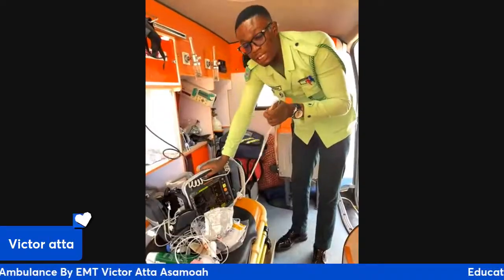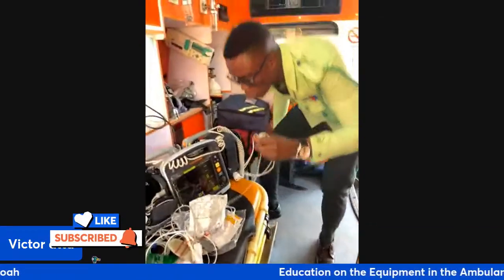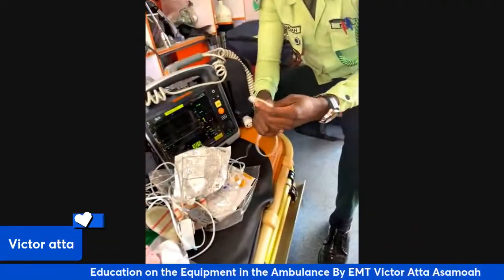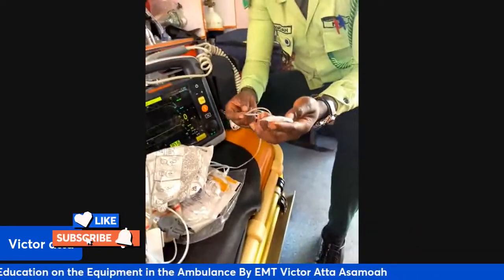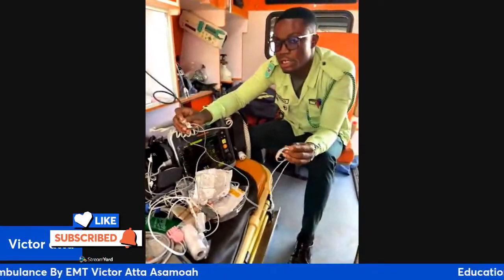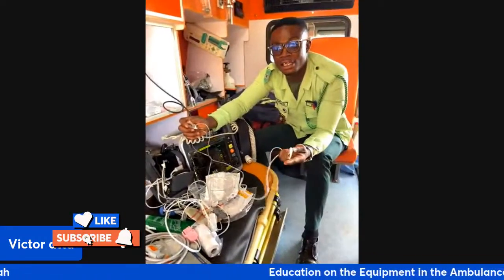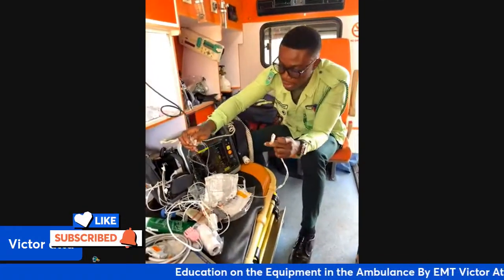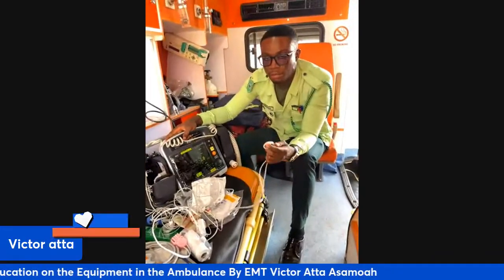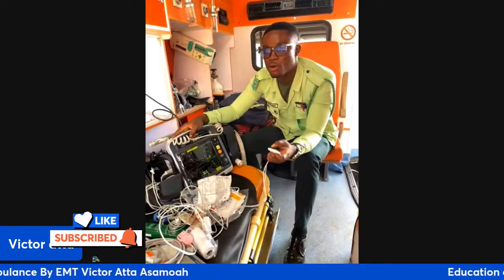transporting a patient, you can only see the SpO2, but what if you want to know whether your patient is alive or not? This vital sign will allow you to know it, because when you're transporting a patient and the patient is not breathing again, the CO2 will stop reading, so that you know whether the patient has gone off or is still alive.